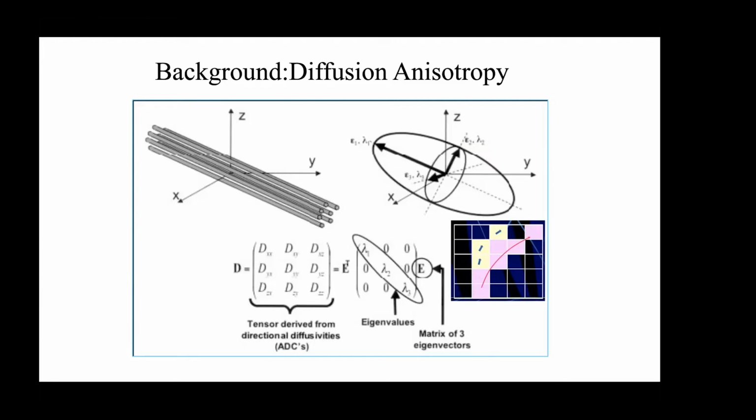I'll briefly describe the sequences, but from the data that we acquire using diffusion gradients in different directions, we can get the mobility in different directions. A mathematical operation is done in order to get the diffusion coefficients in 3 perpendicular directions, visualized as a schematic as an ellipsoid.